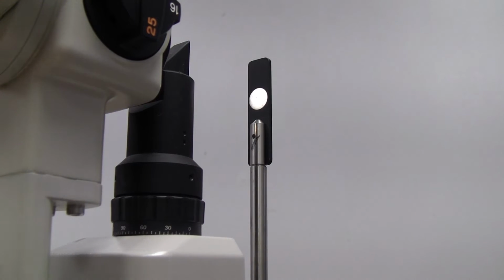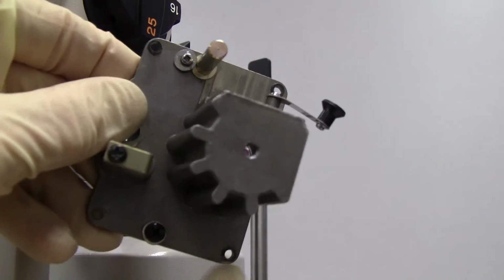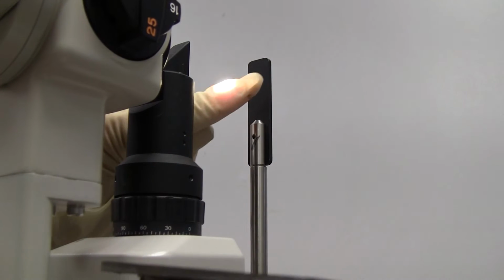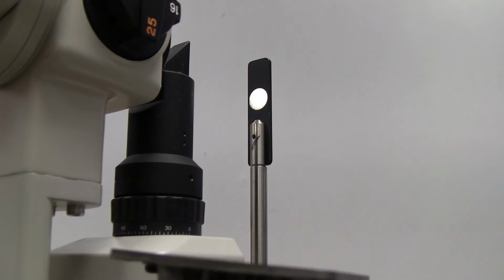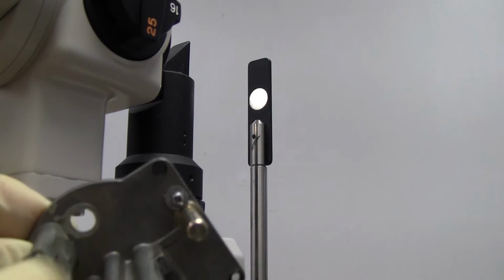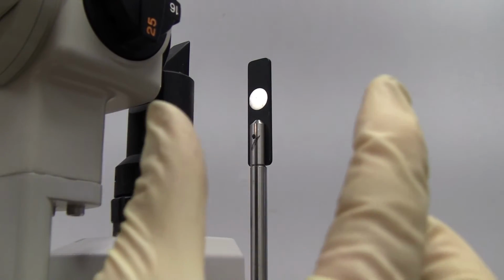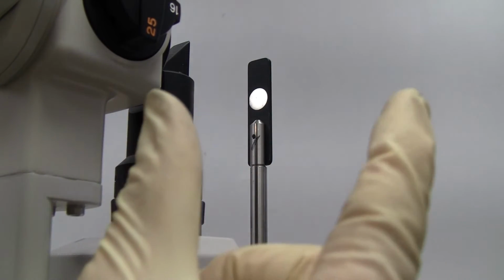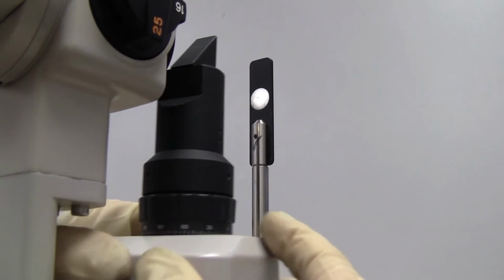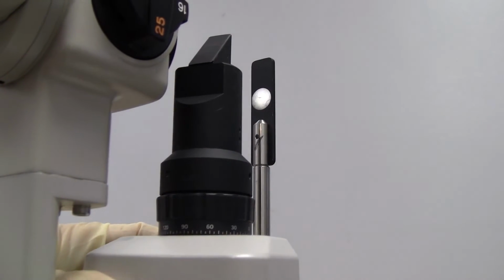Okay, once again, for the alignment, to get your light in the center of your view, I've loosened those 4 and turned the assembly to get the light in your best view possible, and tighten that down. And then your slits might be off, so that's where you would loosen that screw and turn your cam, and that will move the slits one way or the other, so that when you're opening and closing, they're equal. And then for your final alignment, the 2 screws up here where you can move the whole assembly to get it back to where it was. So it's quite a bit of alignment.